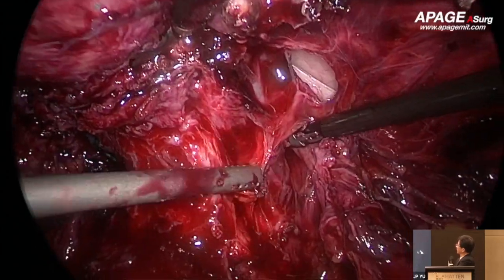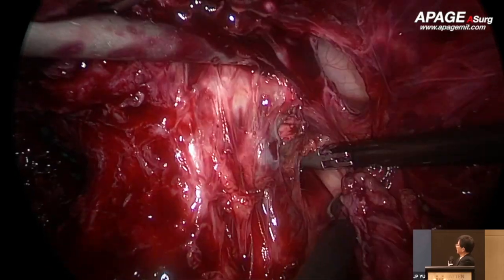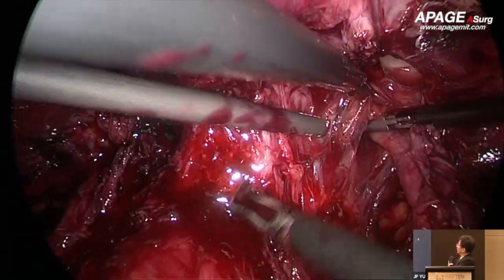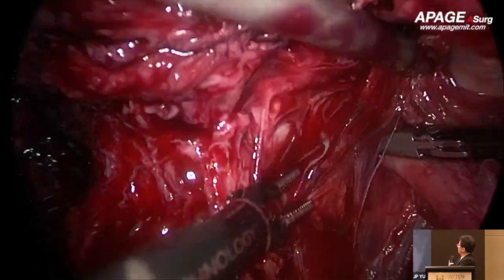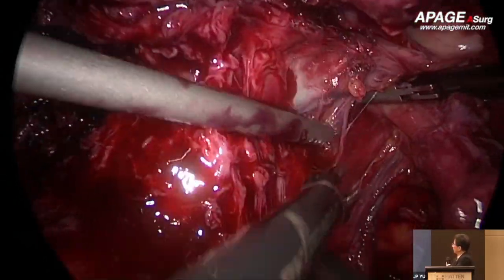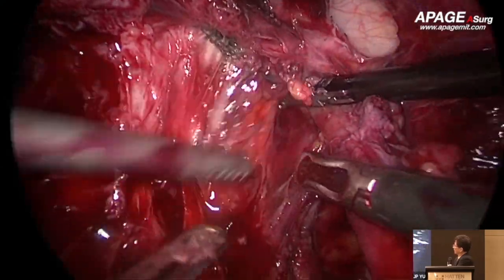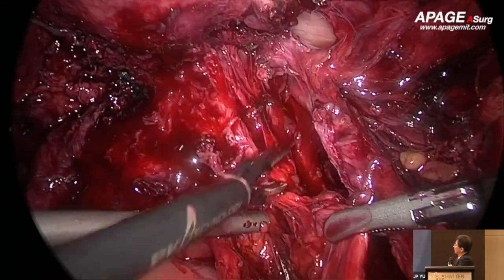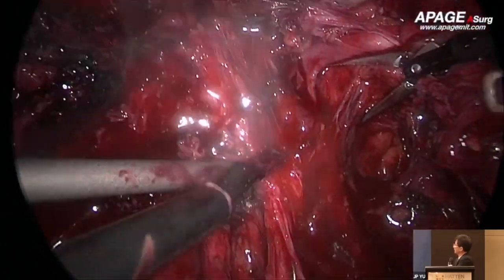Some chocolate contents come out, and there is also some feeding vessels with inflammatory change. Here is the layer of the prerectal space. So we push down the colon and open the prerectal space. Then the pelvic sidewall is almost exposed, and the ureter is just here coming into the anterior. The reason we perform the procedure from the dorsal portion, from the pararectal space and the prerectal space, is that most of the feeding vessels run from posterior to anterior. So if we identify and coagulate the vessels, we can decrease the blood loss during surgery.